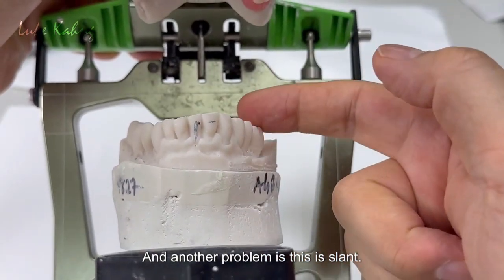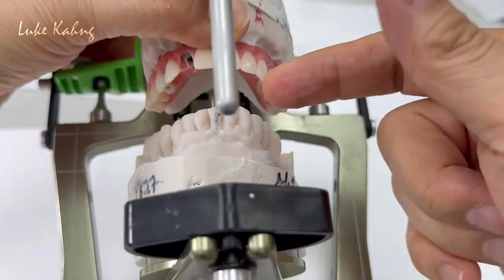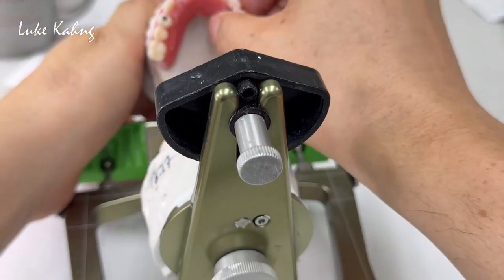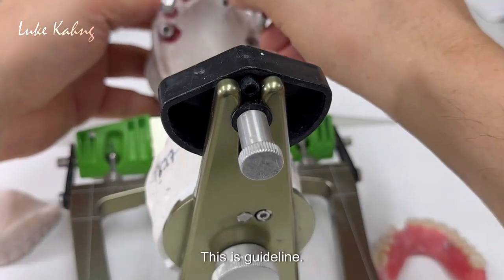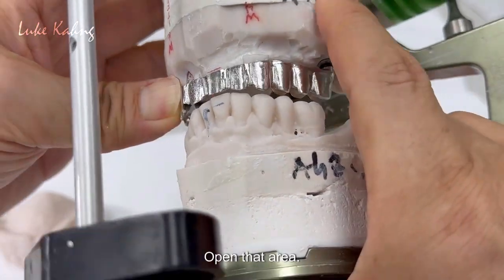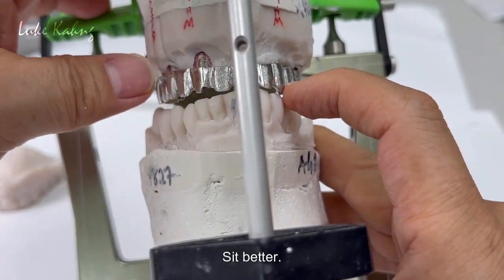Another problem is this is slanted — right here — I have to make more room. Maybe I cannot get a certain area a little bit more open, probably here. Anyway, this is a guideline. This is a conversion — this is a guideline — and we can try to see how much we can open that area. Like I said, here is the lack of room, so we're trying to open it up.